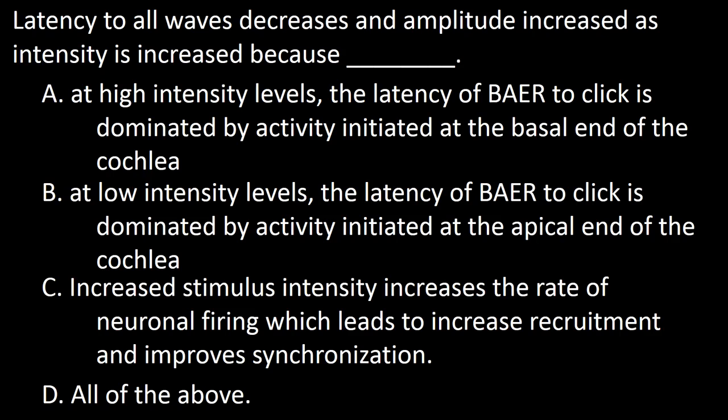Next question. Latency to all waves decreases and amplitude increases as intensity is increased because A. At high intensity levels, the latency of the brain auditory evoked responses to click is dominated by activity initiated at the basal end of the cochlea.